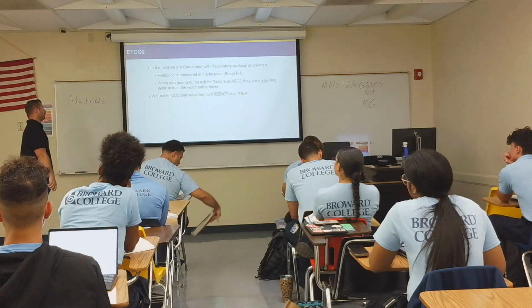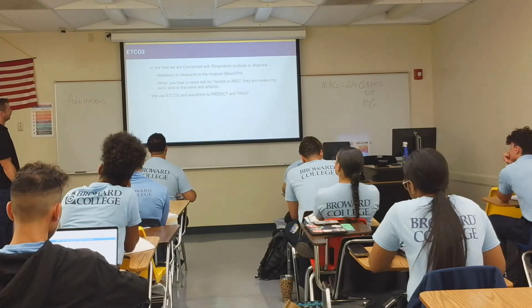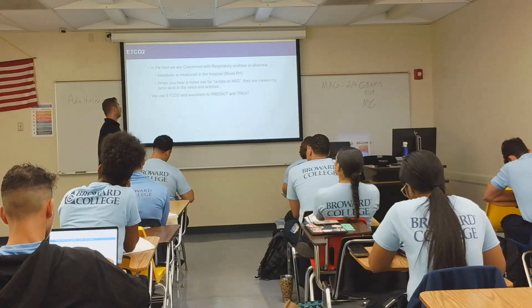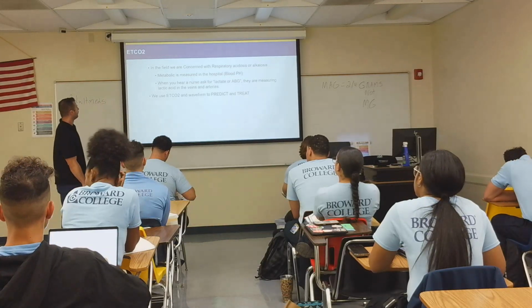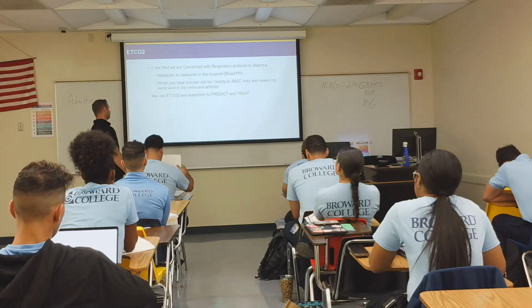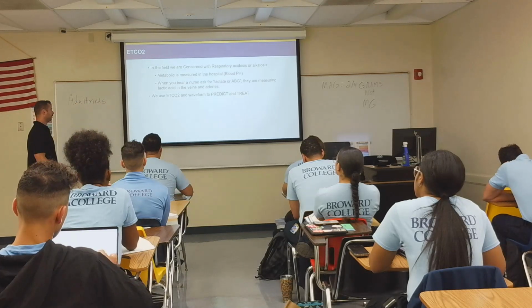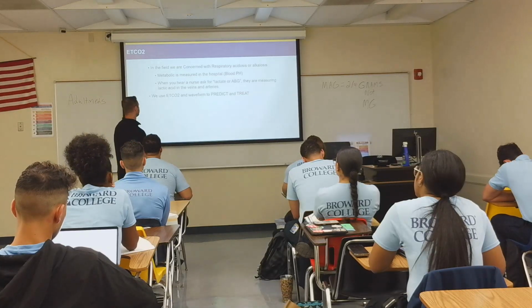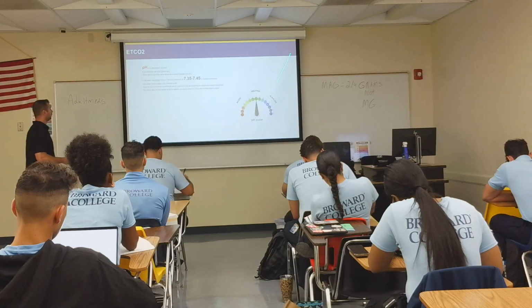So in the field, we're concerned with respiratory acidosis or alkalosis. Okay, the metabolic acidosis or alkalosis is gonna be done in the hospital. It's your blood pH, right? When you hear a nurse ask for lactate, ABG, that's what they're asking. Okay? We use end-tidal, we're not checking blood in the field. Alright? So we can use that waveform to predict and treat. Okay? So there you go, there's neutral.